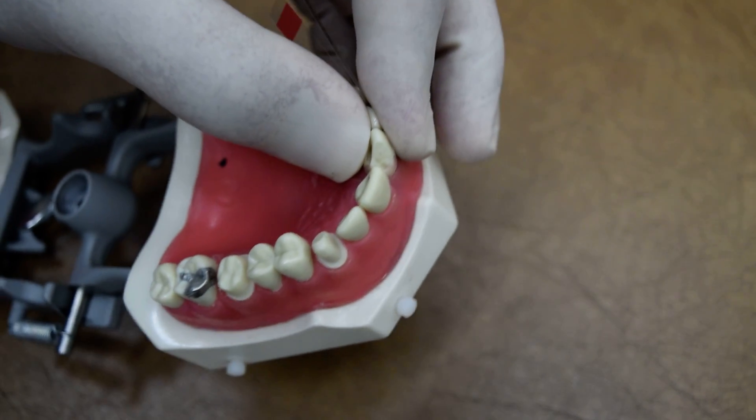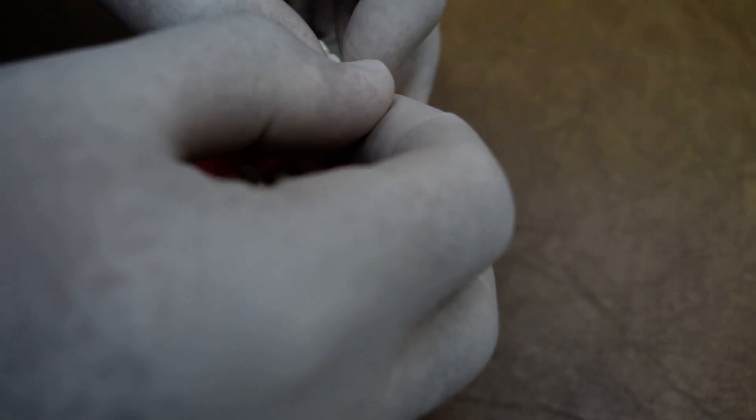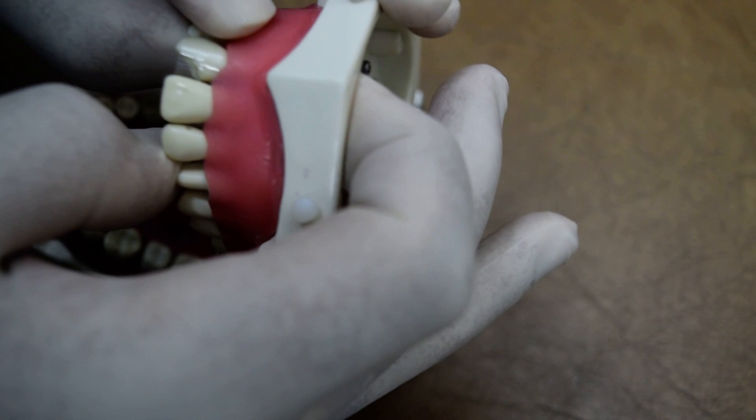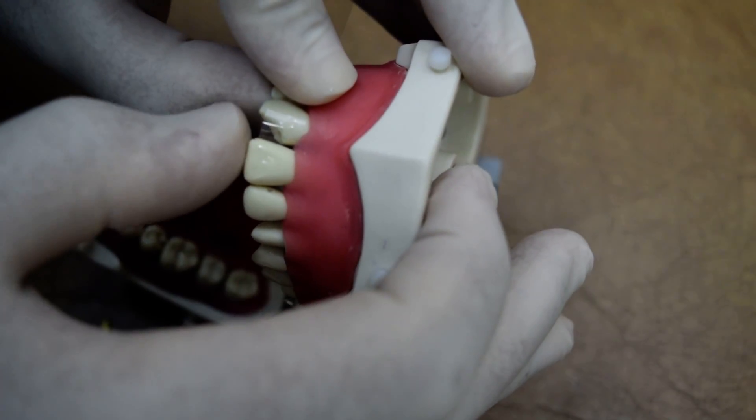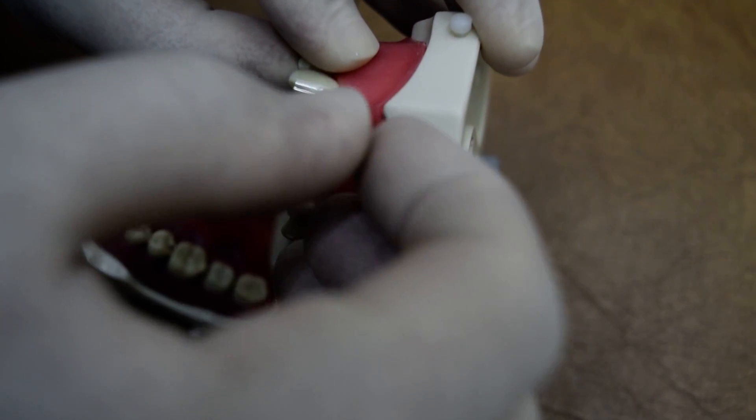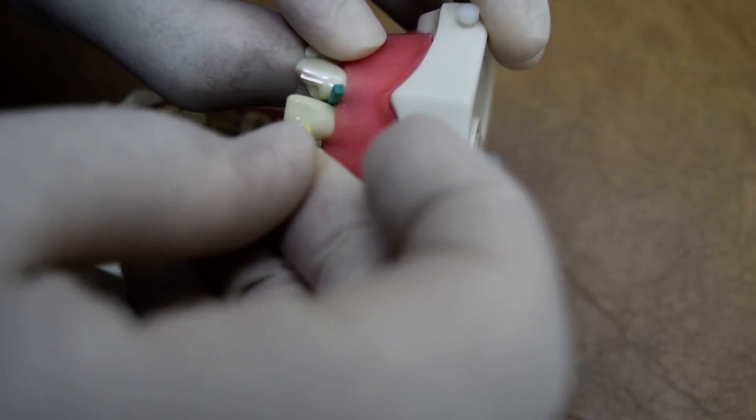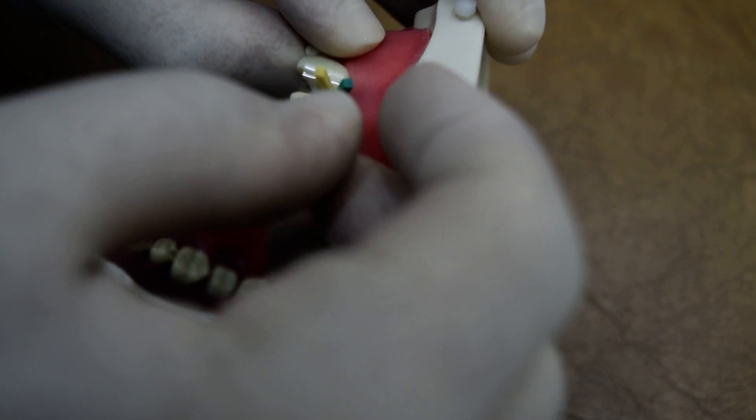So we are going to put the strip as deep as we can to follow the contour of the tooth. Make sure that it's following the contour before you apply the wedges, and I prefer putting here two wedges, one is big and another one a bit smaller, to make sure that there will not be leakage proximally.